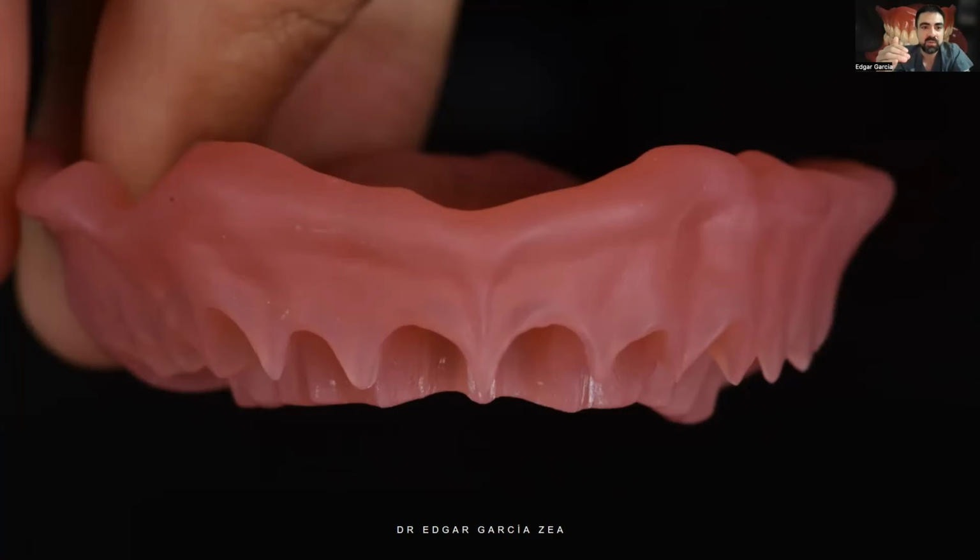We don't have labs to do the Gerber techniques, BPS techniques, okay? Maybe 1 in 100 laboratories, okay? So the thing that I was searching while reading, investigating, trying with my patients at the clinic, at the university, was to obtain protocols that we can do at every level of dentistry, in every socioeconomic level. Exactly. So the milled prostheses were not an option, okay?